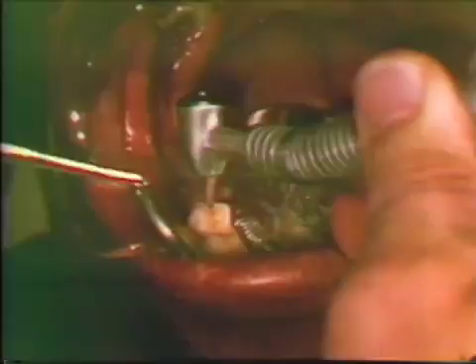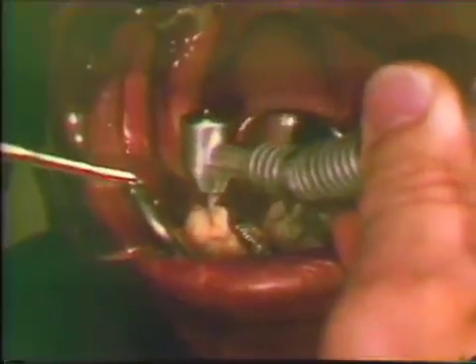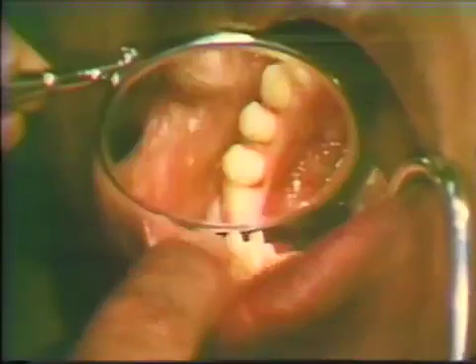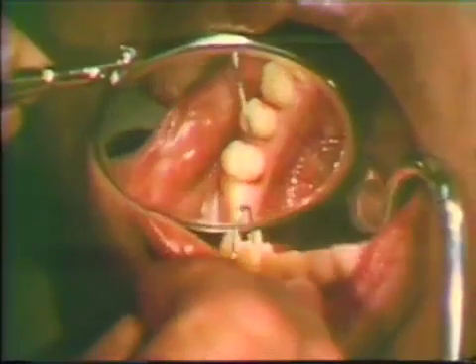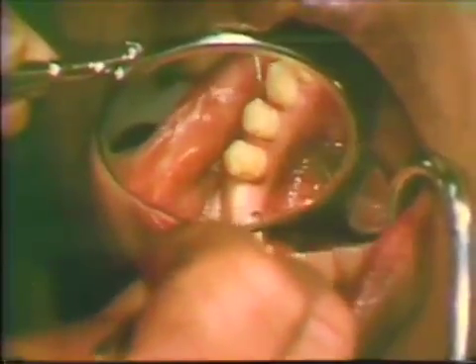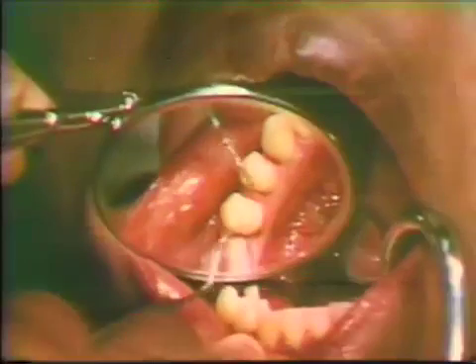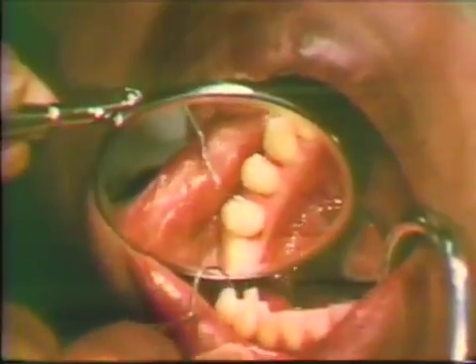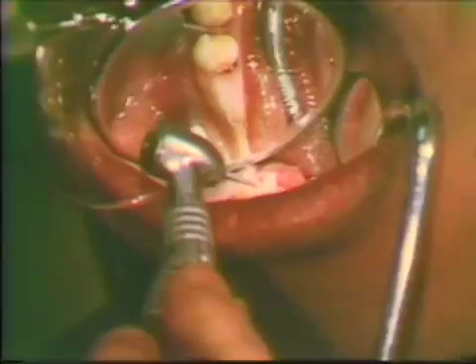The box preparation and occlusal anatomy is prepared with a carbide bur. The box preparations that are to house occlusal rest seats should be extended buccal-lingually beyond the normal box preparation limit. The cervical finish line is established and cusp and occlusal reduction is achieved to the level previously determined on the study cast.